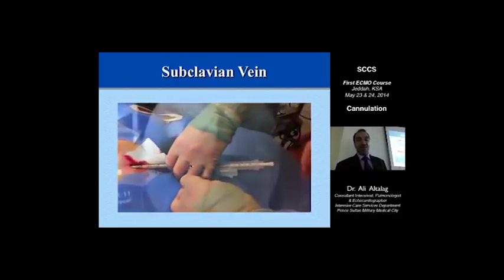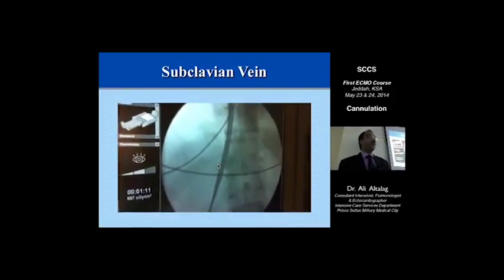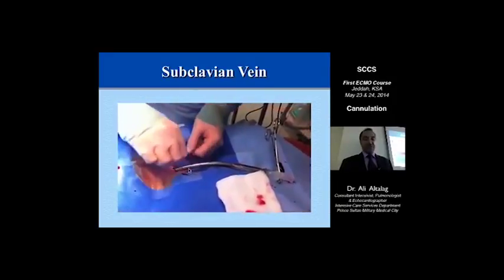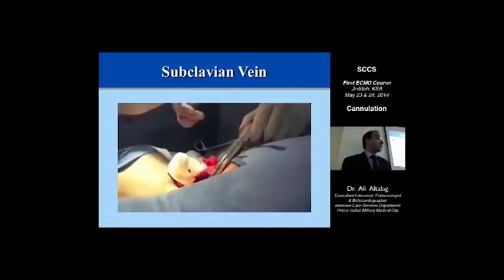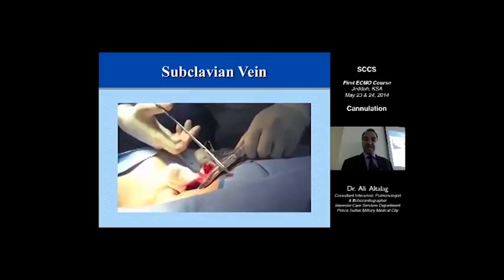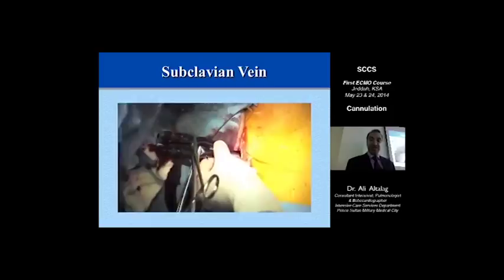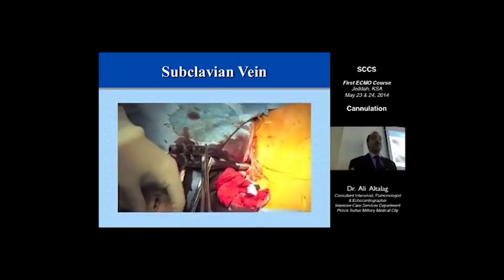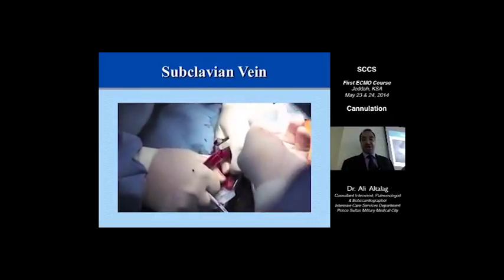Okay, and now with fluoroscopy, you just adjust your catheter so that the tip of the catheter is just beneath the inferior vena cava. Fix your catheter. Now this applies to these single lumen catheters as well. And then you have to fill up that catheter with blood by removing the plug here, and once blood comes out, clamp the catheter. This is an airless system, so you have to make sure that there's no single air drop in the system.